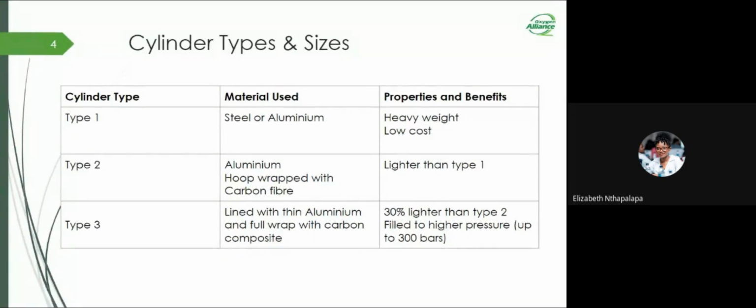And also, to add on Masanja's comment on the MRI and the cylinders, it is really true that the MRI is very magnetic, but there are other situations where you still need to do a gas delivery around the MRI machines. These gases will be carried using cylinders.